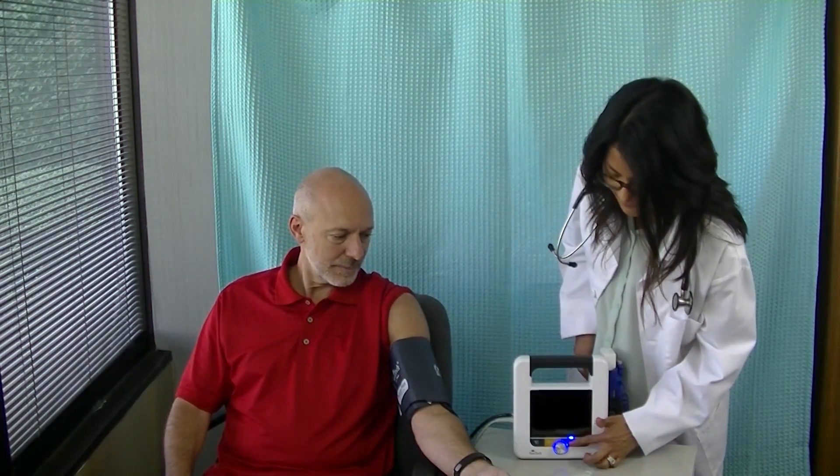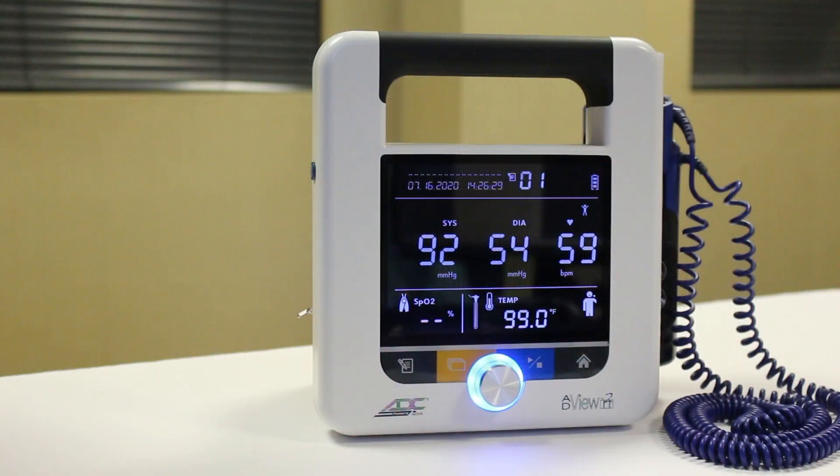When the cuff reaches an appropriate pressure, it begins to deflate. The reading should appear in about 30 seconds. A long beep will indicate that the measurement is complete.